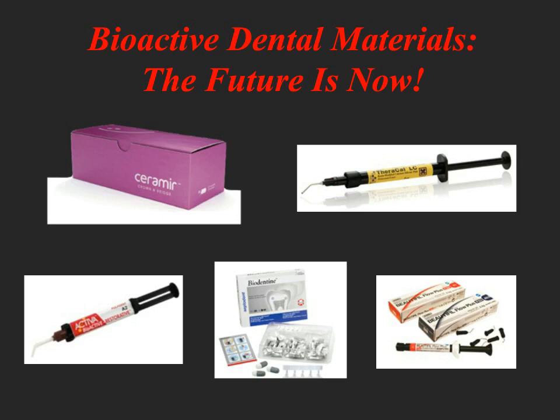It's a GIOMER technology that's incorporated into this composite. The glass particles of this composite are coated with a layer of a glass ionomer type phase that is then protected with a harder coat so ions can be released from this material over time.